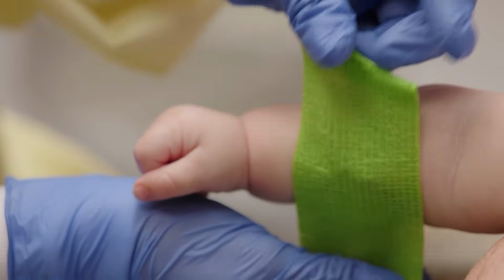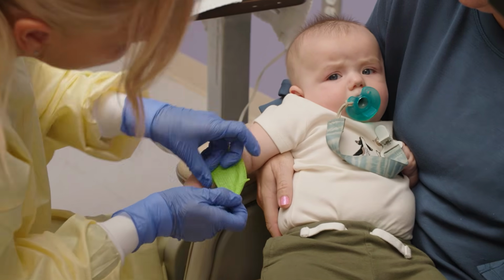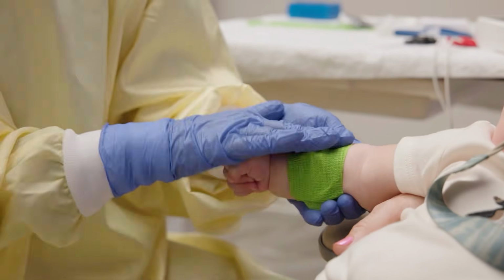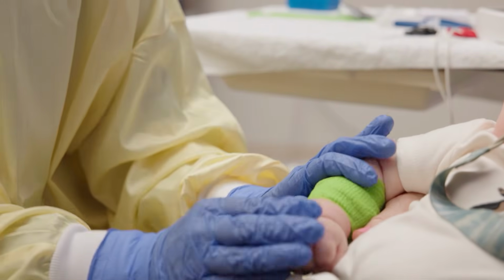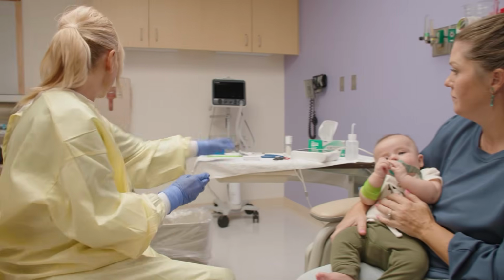For infants and toddlers, wrapping a self-adherent elastic wrap or paraffin wax sheet around the collector can help maintain contact with the skin and keep the collector in place. You'll need to unwrap to take a look underneath throughout the procedure. Start the timer and document the start time for collection.